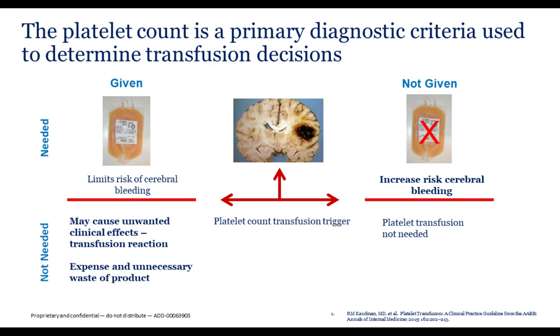The optical platelet count has occasional interferences, maybe from plasma proteins if there are aggressive aggregates. Sometimes there are interferences from microcytes, and this can occur if the schistocyte or the microcyte is abnormal. In such a case, that would emulate a platelet. Most likely, this will not occur. This is actually rare. Interferences from RBC and WBC fragments occur occasionally. But again, distinguishing the platelets from the red cells, even in fragmentation form, the platelet is usually considered denser due to the granulation and will separate from these.